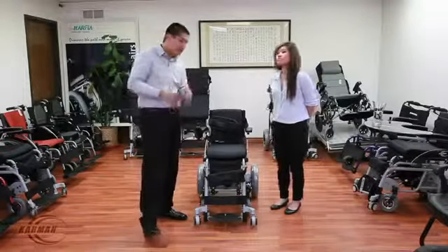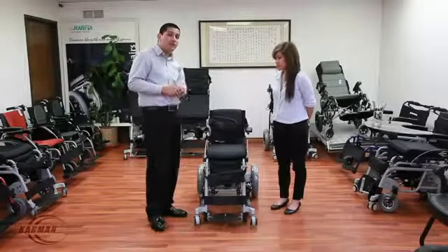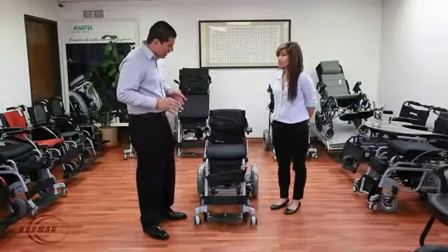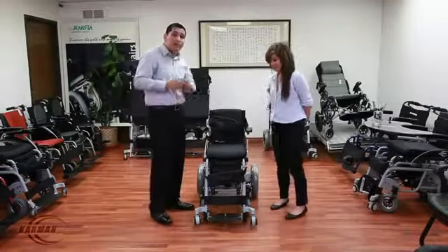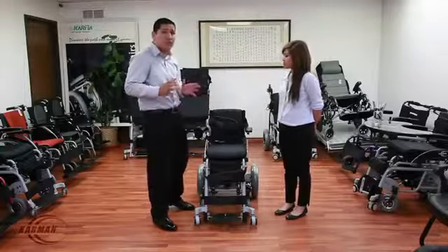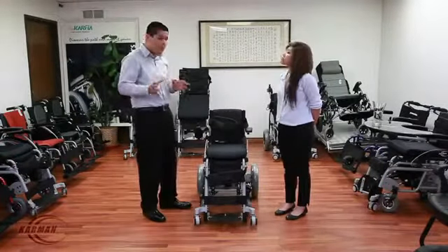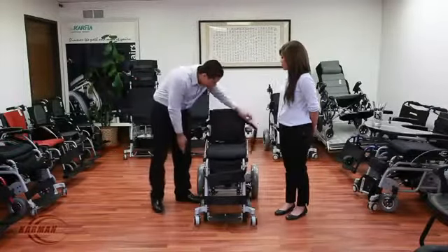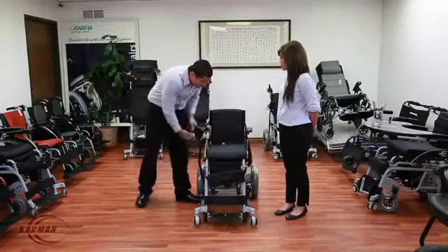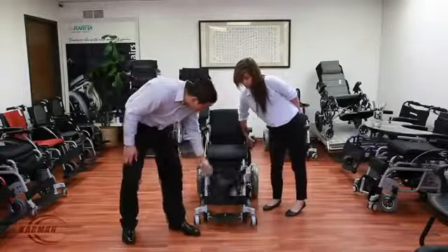I'm going to show you guys some features and safety factors on the chair to ensure your loved one is nice and secure. I'm going to have Janice sit in the chair and we're going to fit and adjust it just for her. I'm going to show you guys how to do every single step. Let's start with Janice sitting in the chair and adjust everything to her liking.